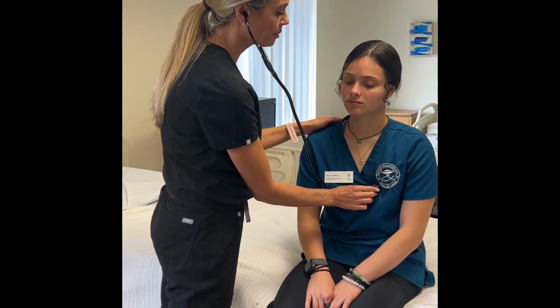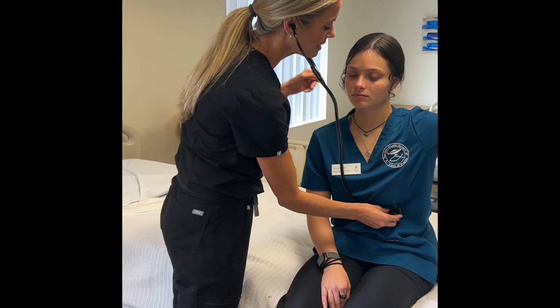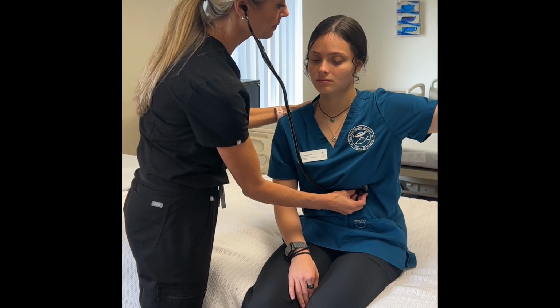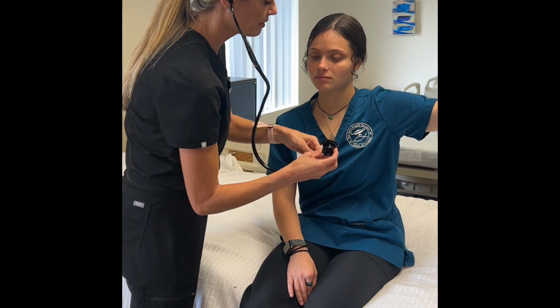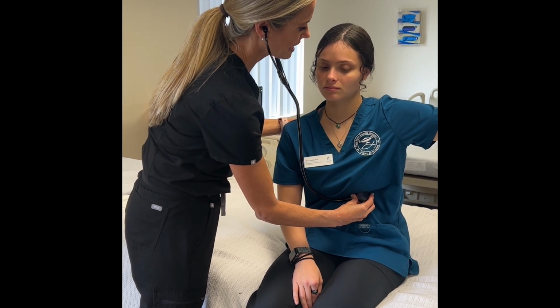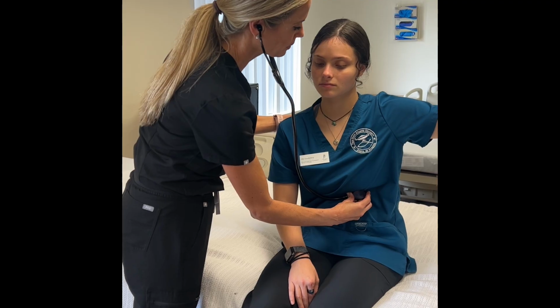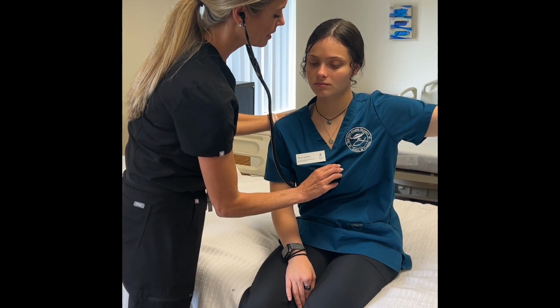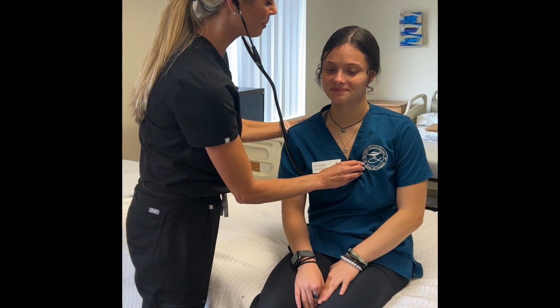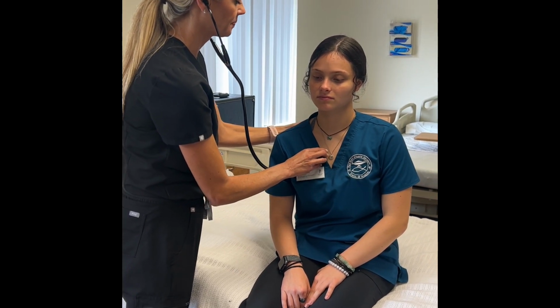And can you raise your left arm in the air? Thank you very much. Fifth intercostal space, midclavicular line is mitral. And then I'm going to flip to the bell and come back up. I use the bell because sometimes I can hear certain murmurs better with the bell. They hear duller pitch sounds. Okay. Tricuspid. You can put your arm down. Second pulmonic, pulmonic, and aortic.